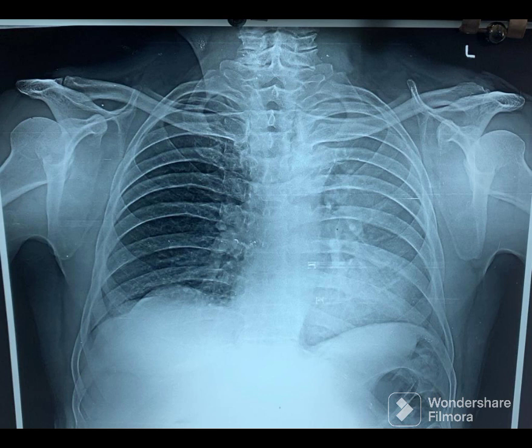Note the diffuse haziness on the left. It is called the veil sign, or veiling density, or veiling sign. It classically occurs in left upper lobe collapse. The left upper lobe collapses anteriorly, becoming a thin sheet of tissue opposed to the anterior chest wall, and appears as a hazy or veiling opacity.